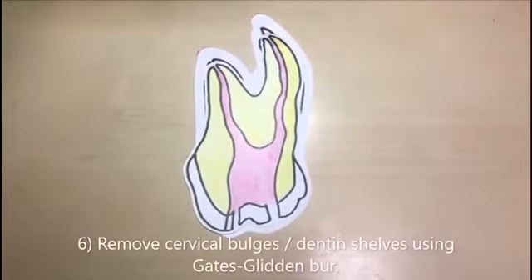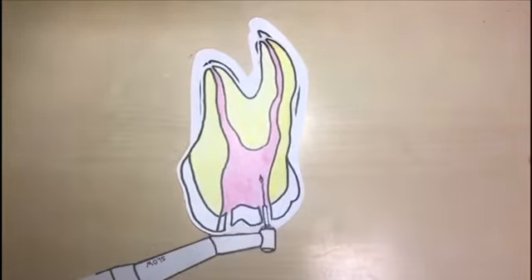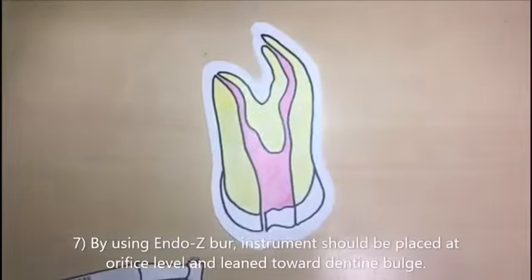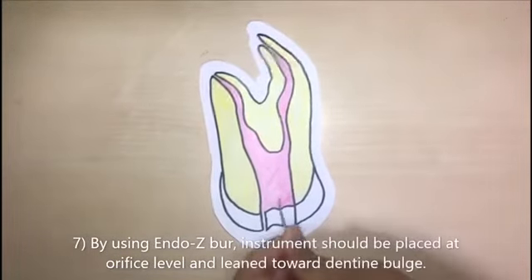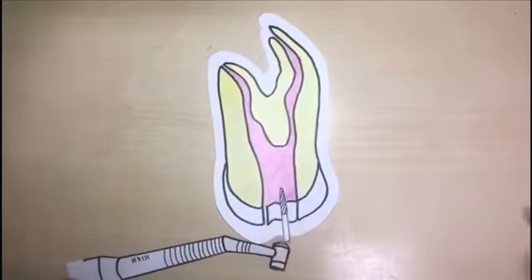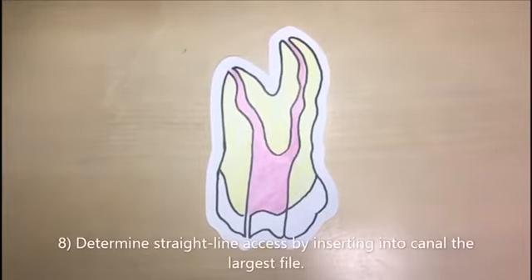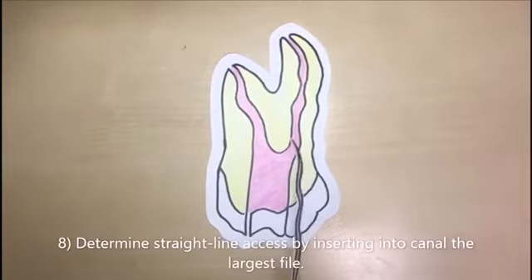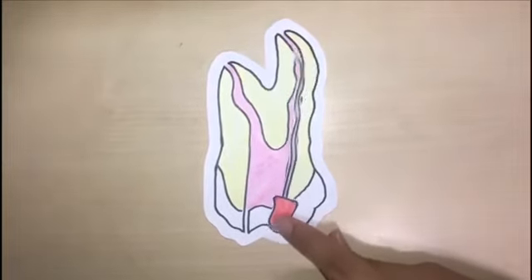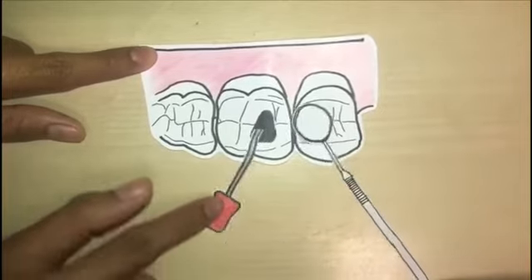Remove cervical bulges or dentin shelves using carbide burr or Gates-Glidden burr. Using endo-Z burr, the instrument should be placed at orifice level and lean toward the dentin bulge. Determine straight line access by inserting the largest file into the canal. Visually inspect and evaluate the access cavity.